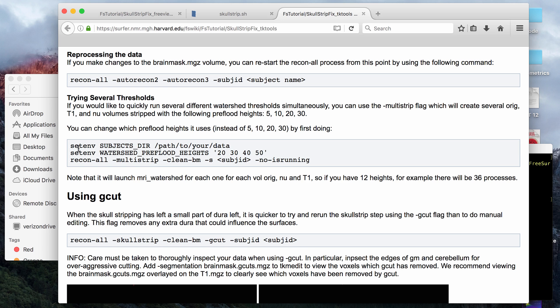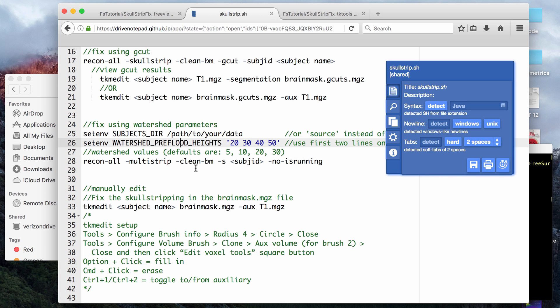If you go into... I usually use bash, but if you use cshell, then you can use set environment, and these first two lines will give the path to your data, and then you can put in whatever values you want. You can change the values here, and then you run this last line, which is the multi-strip command.